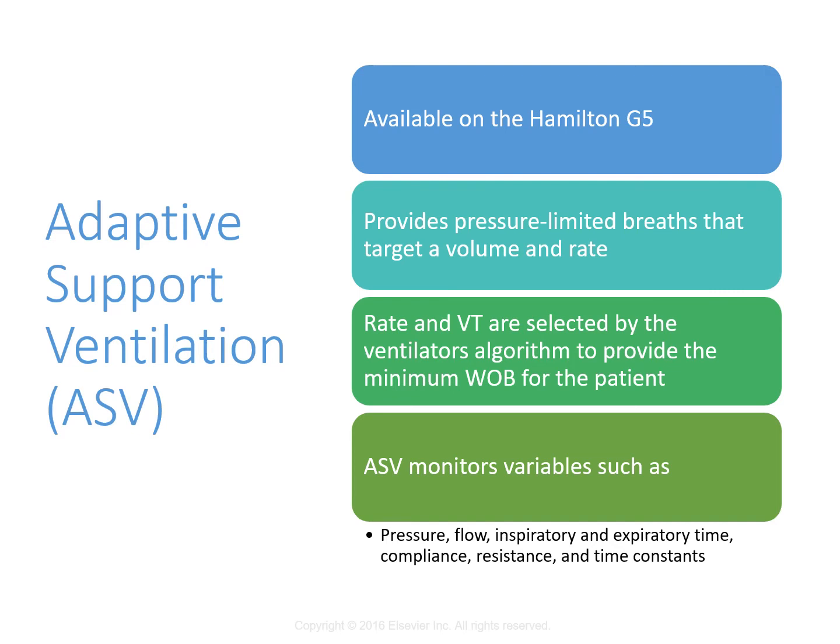So it looks at pressure, it looks at flow, it looks at inspiratory and expiratory time, it looks at compliance and resistance, time constants, and it does this to ensure a delivery of acceptable minute ventilation based on what you have set. So the settings that you're doing include the patient's ideal body weight that you're putting in there and a high pressure limit. You're also going to put in a PEEP, FiO2, rise time, flow cycle, the percent of predicted minute ventilation desired, and then that will change with altitude in certain situations and certain clinical processes.